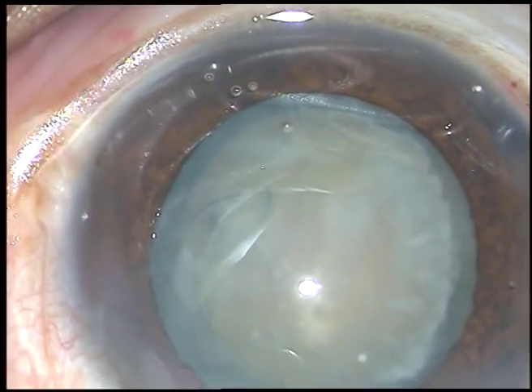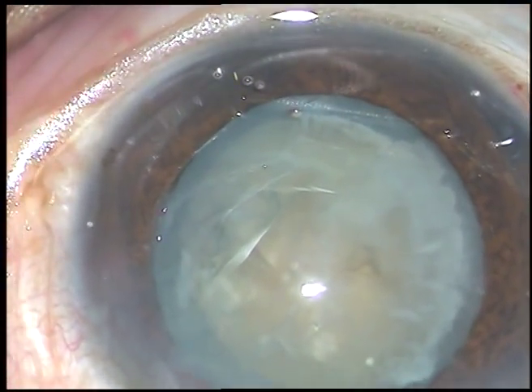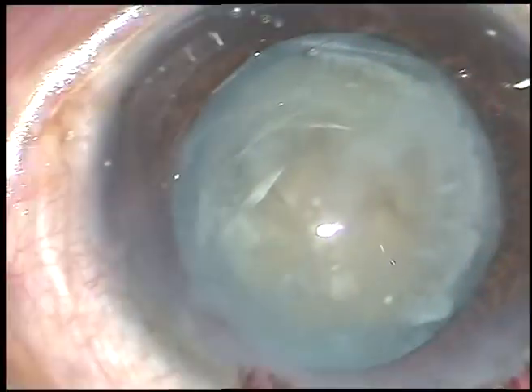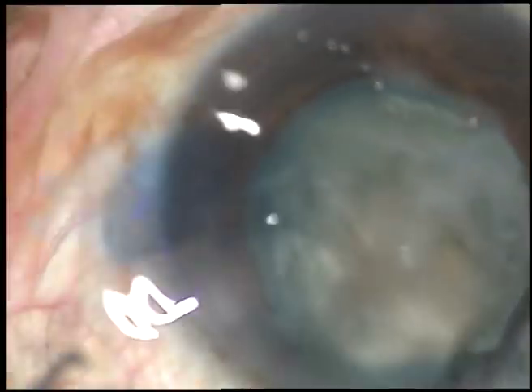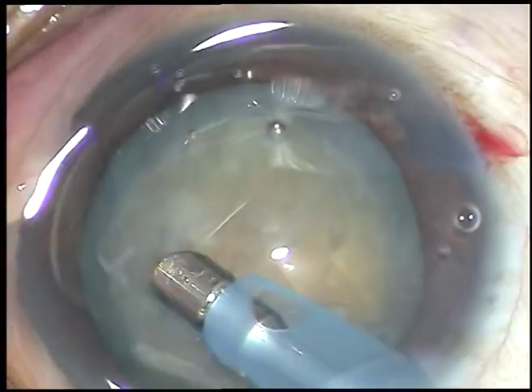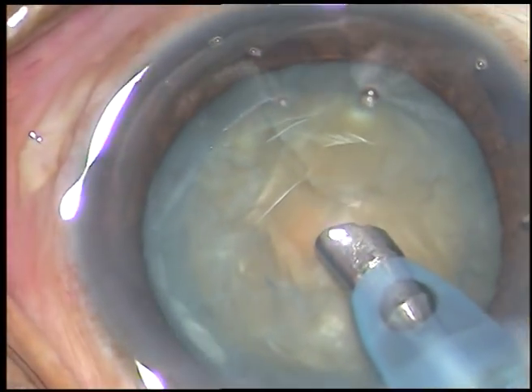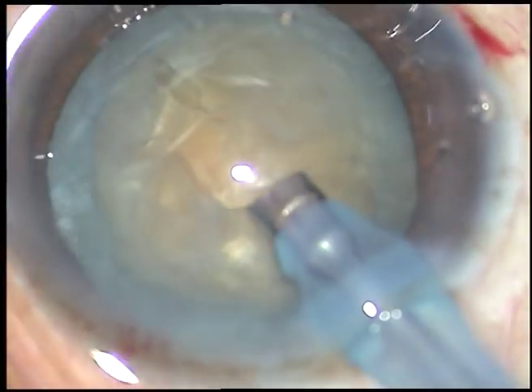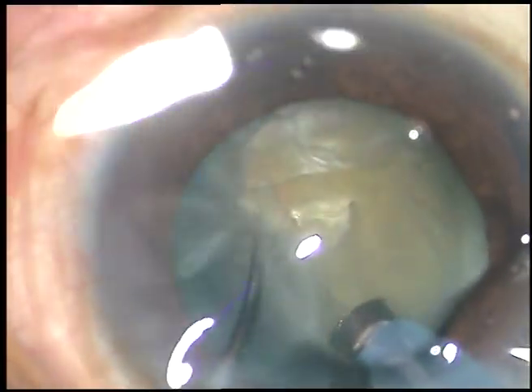Nucleus sclerosis in this case is about grade 3 or grade 3 plus. Now I am going to introduce the tip of the FACO handpiece. The machine being used is Oertly Catarix 3. The vacuum is 450 and flow rate is 45 from the very beginning. The power in this case has been set at around 70%. You can see the brownish tinge of the cataract, indicating that it is a little harder than grade 3.